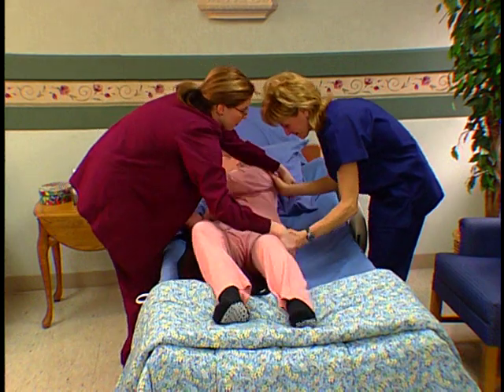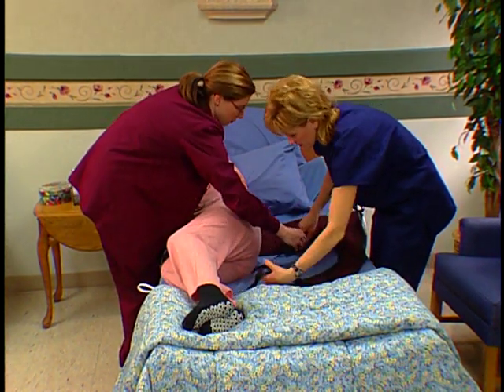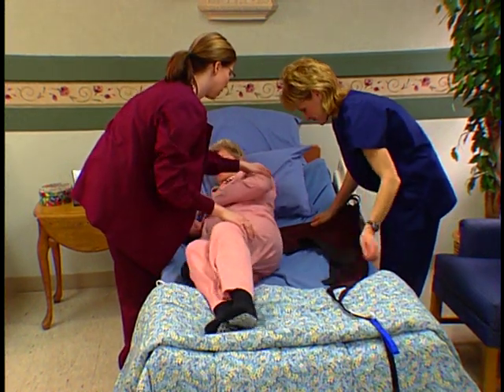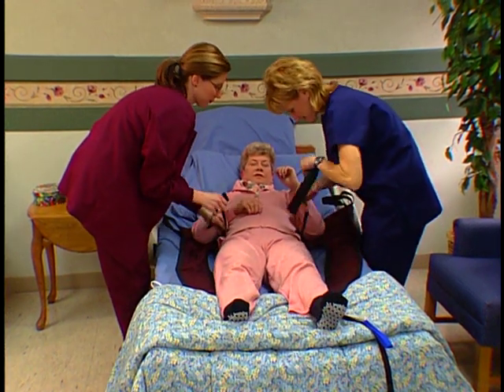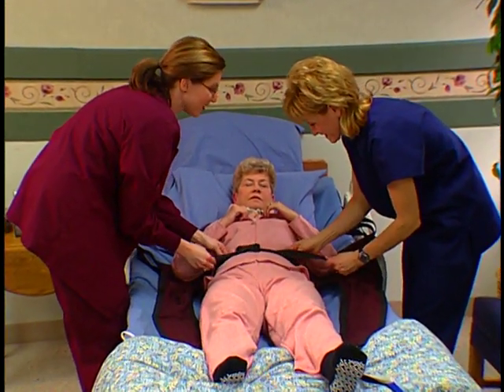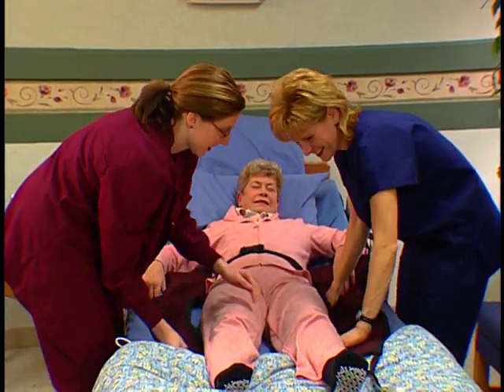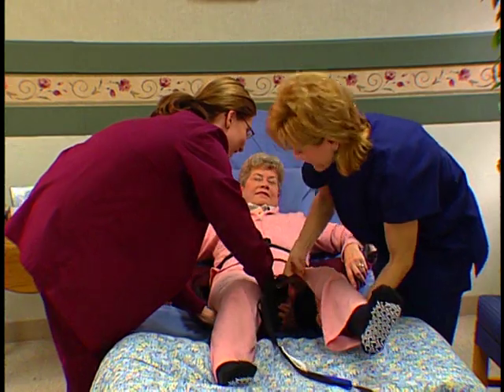The toileting sling is placed on the resident in a similar manner as the Volaro divided leg sling, except make sure the person's arms are on the outside of the sling and that the U portion of the sling will not go all the way to the person's tailbone. Also, position the material as close to the bend of the knee as possible. This will allow more clearance for disrobing. The leg straps will crisscross the same as the Volaro divided leg sling.